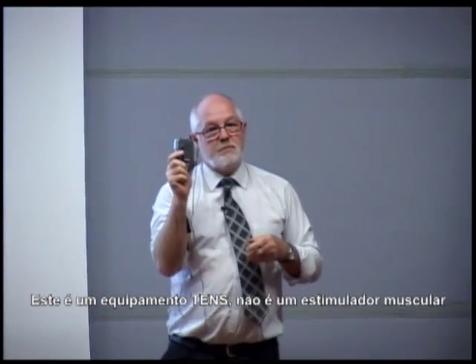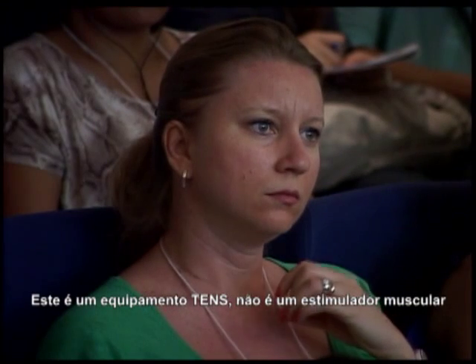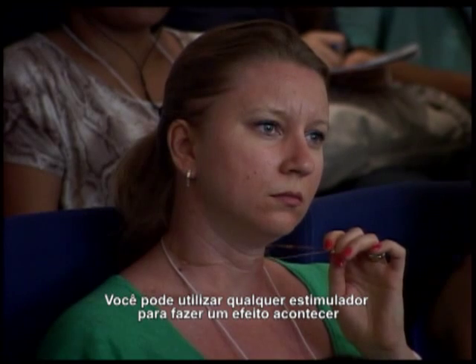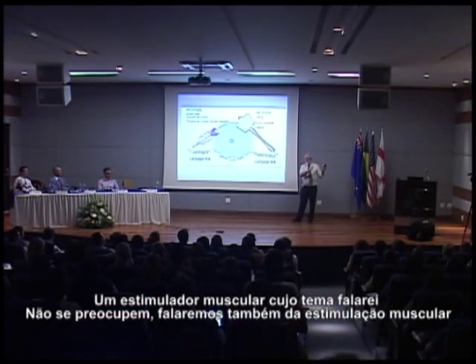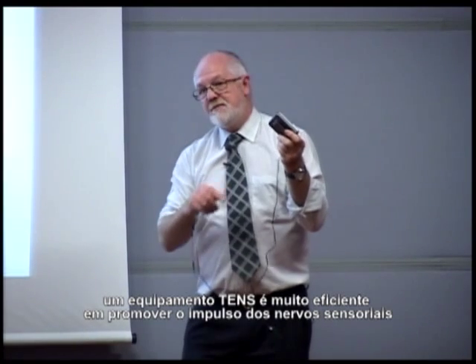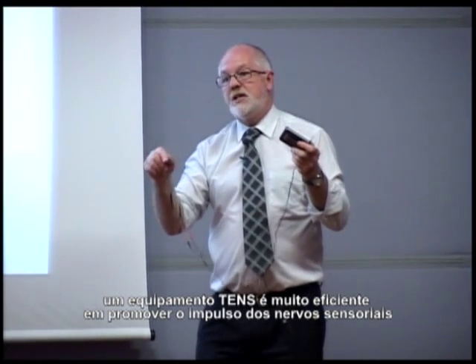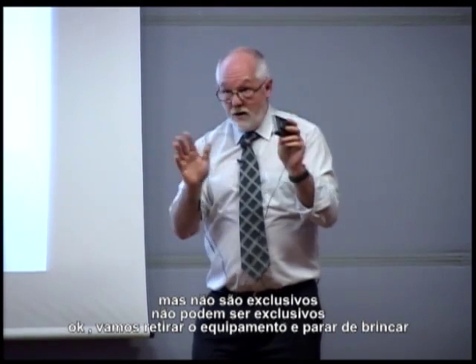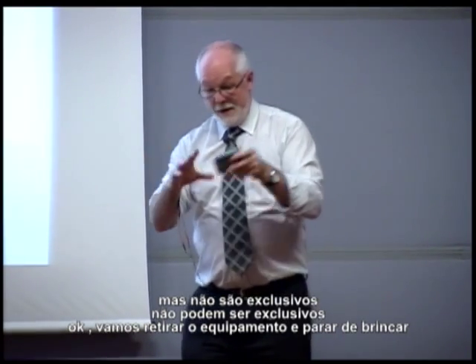That is a TENS machine. It is not a muscle stimulator. You can use any stimulator to make an effect happen. A muscle stimulator, which I'm going to talk about, don't worry, we will talk muscle stim, is very efficient at making motor nerves fire. A TENS machine is very efficient at making sensory nerves fire, but they're not exclusive. They can't be exclusive. Okay?